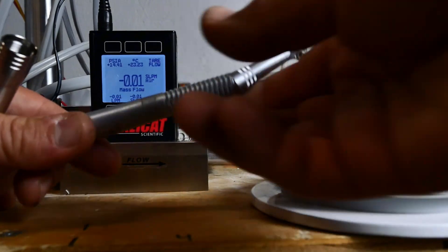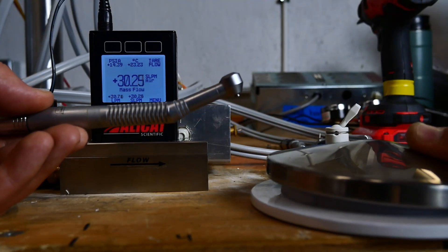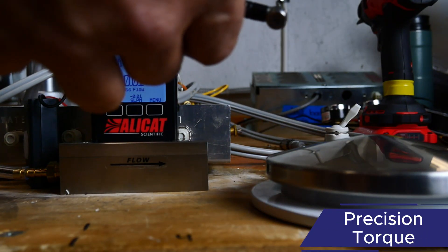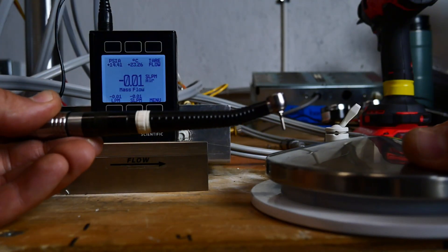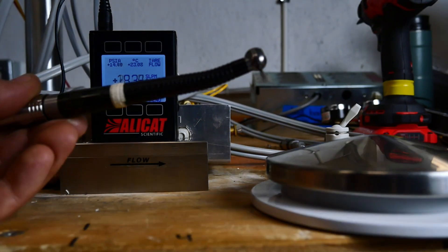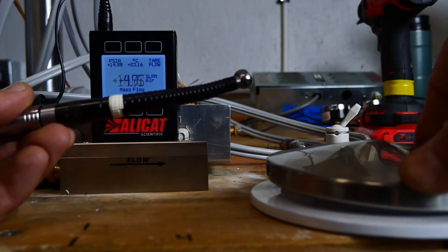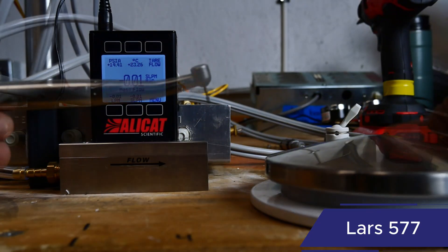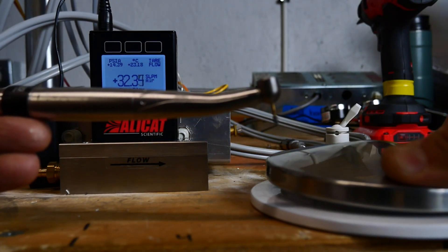Next is a big Kavo — a Kavo Super Torque 625 seat — that reads 30. Then we have an old Precision Torque manual hand piece, which reads 23. Next, the Lars 577 comes in at 32.